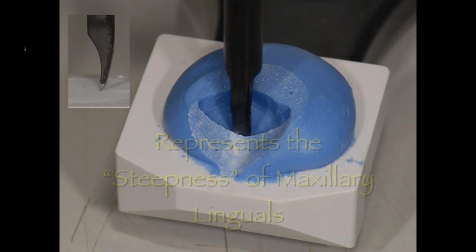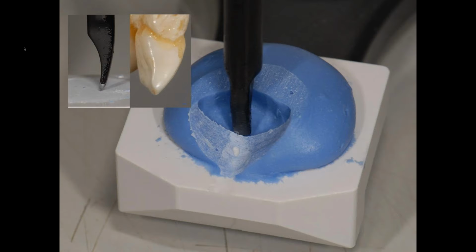And this pin, actually, we designed this years ago, and we kept grinding on a pin until it actually got out of its own way. Okay, the big bullnose pins, they get in their own way, and you can't make an accurate guide table with those. But this pin, which at one time was actually called the Fillastre pin, is available from Dana. It's called the Anterior Determiner.